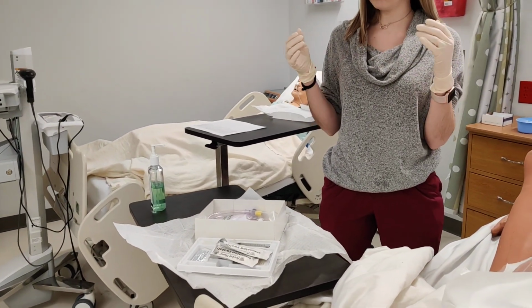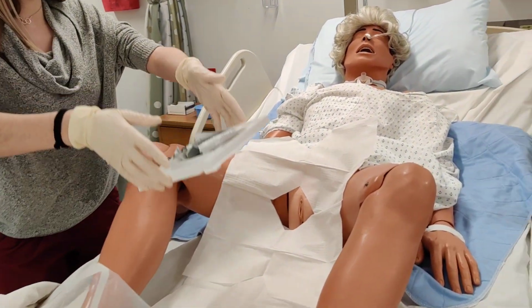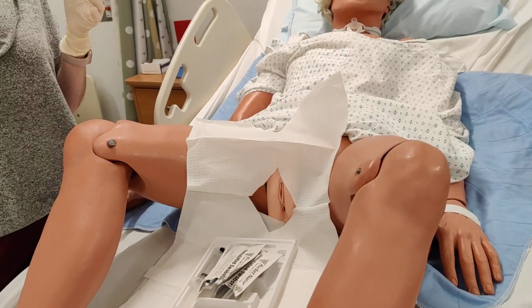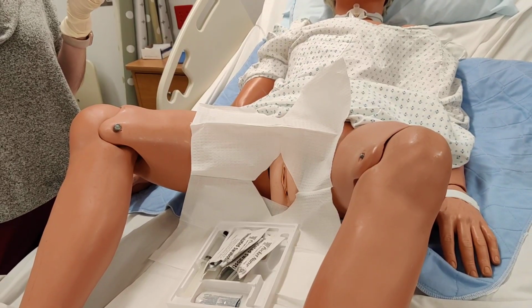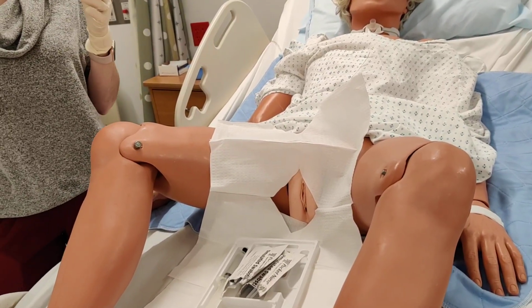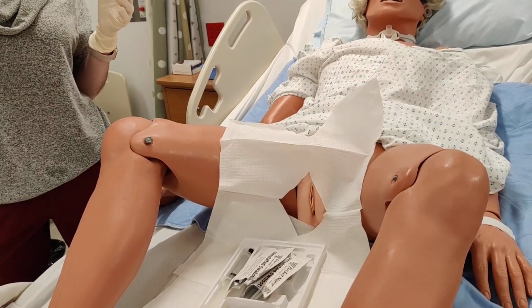Right, so Gabby could bring that top tray over to the sterile field that we have on our patient's bed. That is sterile to sterile, so it's fine to move that kit over. All right, once she's moved everything, we have to determine a dirty versus a clean hand. One hand is going to be used to spread the labia apart so that we can visualize the meatus. The other hand is going to remain sterile so that the catheter can be inserted.